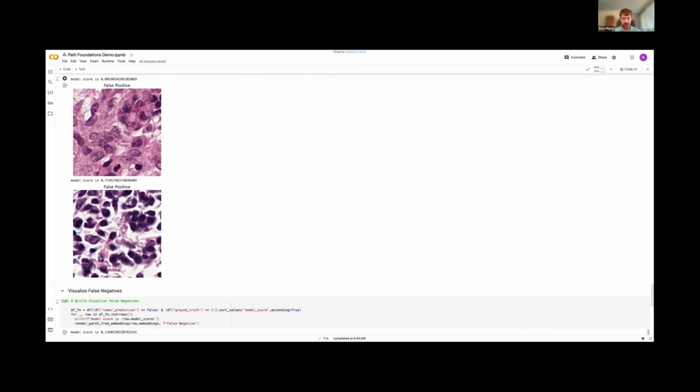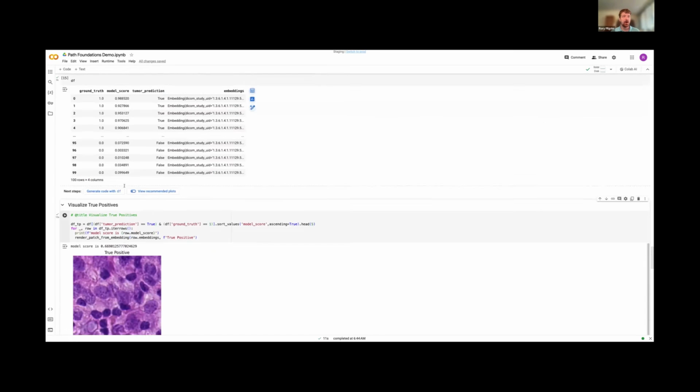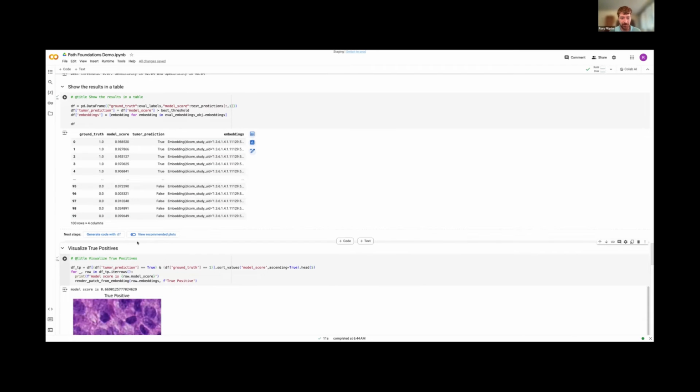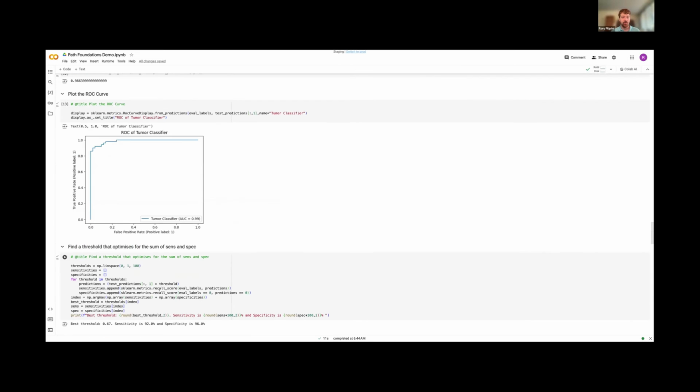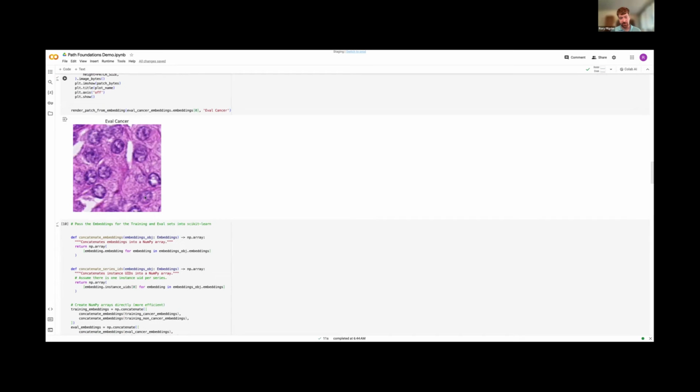So there's variance across patients and tissue specimens, but also within the tissue, there's just a huge amount of information that we're feeding into the model to learn about which areas are of interest. And what we've done in this demo is just train a tumor, no tumor model with a total of 500 patches. Now, if you want to play with this, you can actually use less and see what happens there. I'm not going to try and do that because when I code live, it's going to be a disaster. But it's very easy for you to reduce the number of patches we're pulling in here and just see what the performance is there. You can run that experiment yourself.